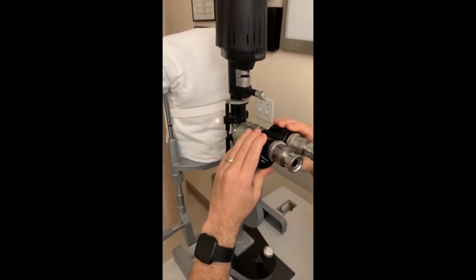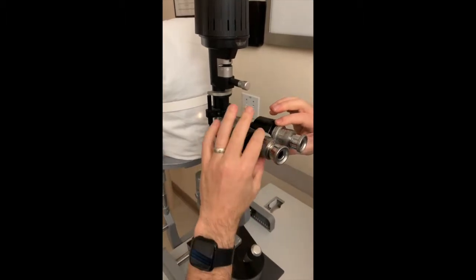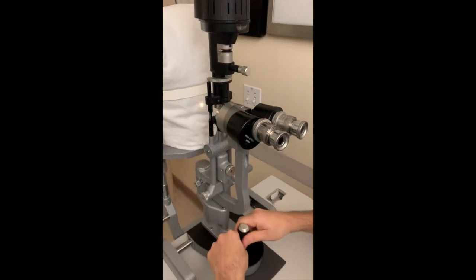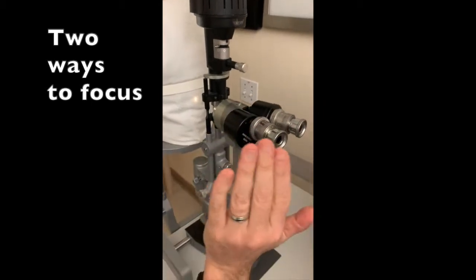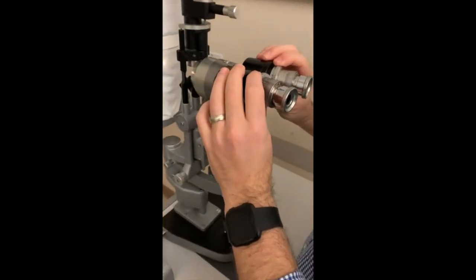Now if one eye is slightly out of focus, then you focus with one eye using the table, and then you focus with the other eye adjusting this, so that both eyes will be in focus if you have different focal lengths with each of your eyes. But for the most part, you can just leave it at zero.